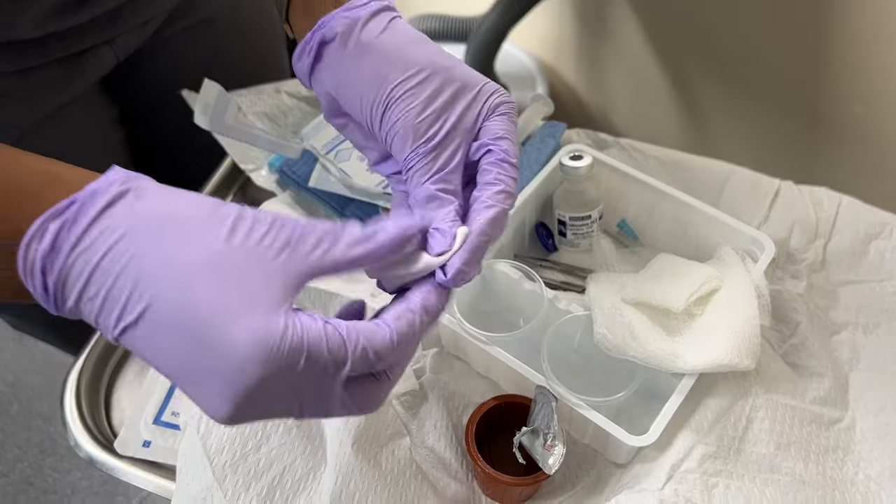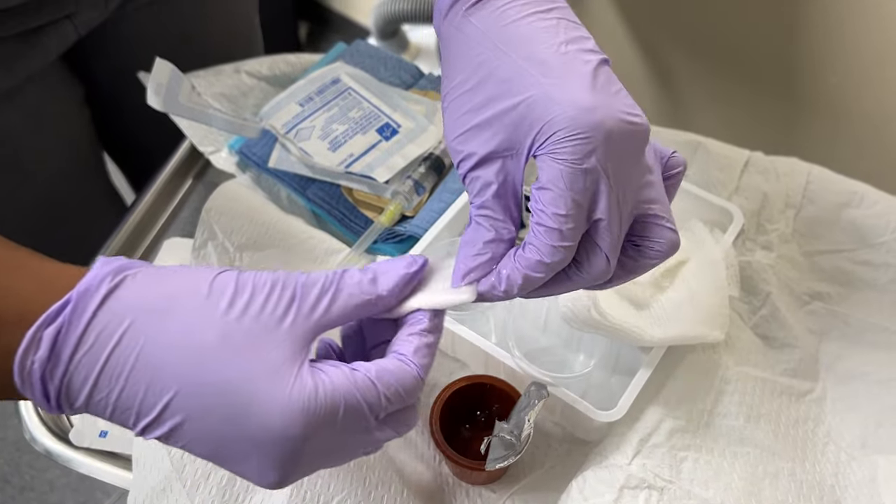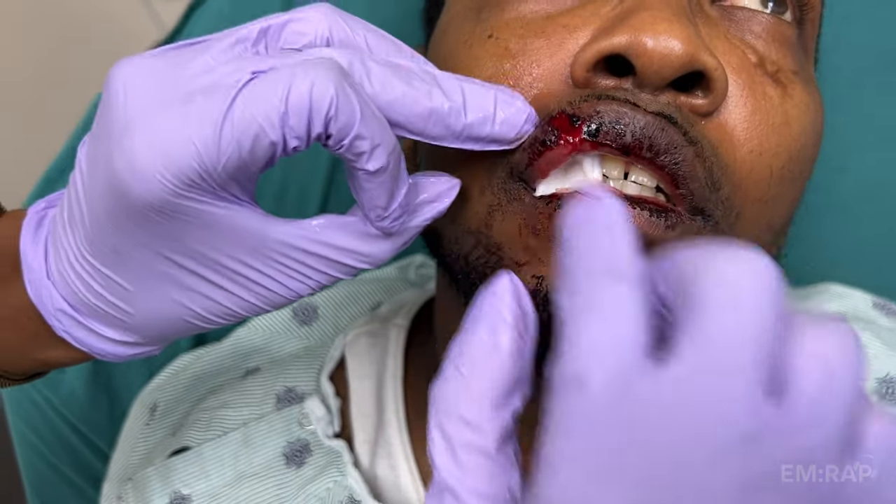Before an intraoral injection, I recommend applying topical lidocaine to the site, which can be done with viscous lidocaine on a 2x2 gauze or with a commercially available lidocaine product, leaving it in place for a couple of minutes.